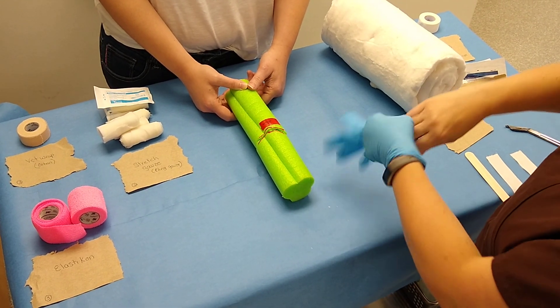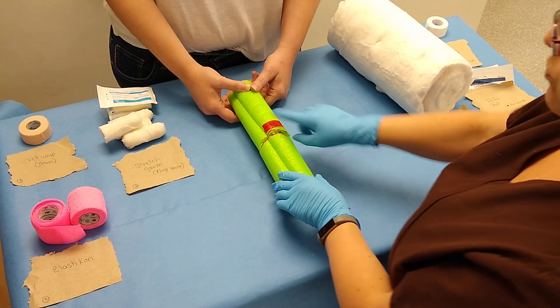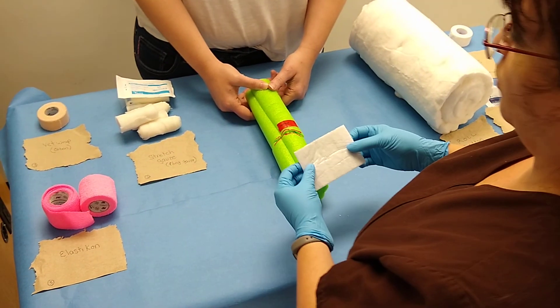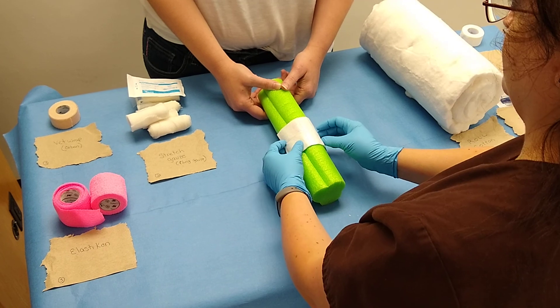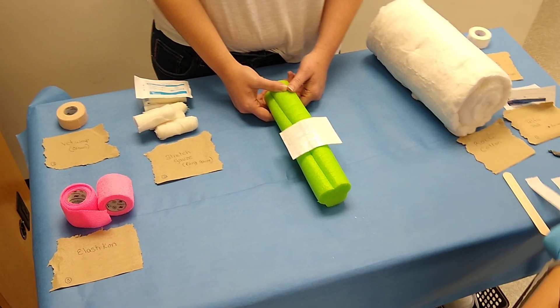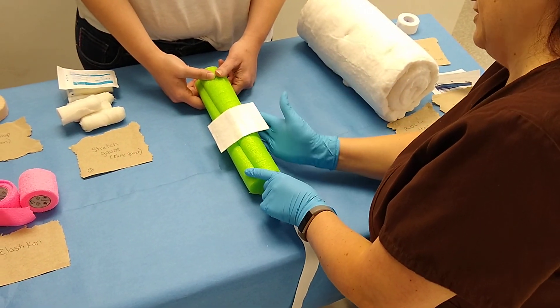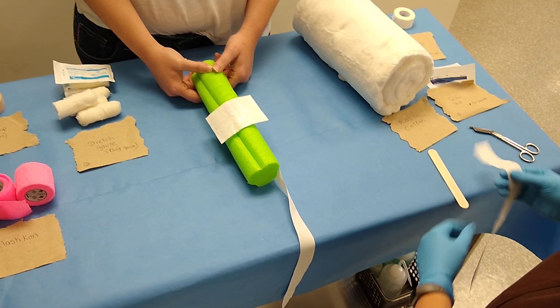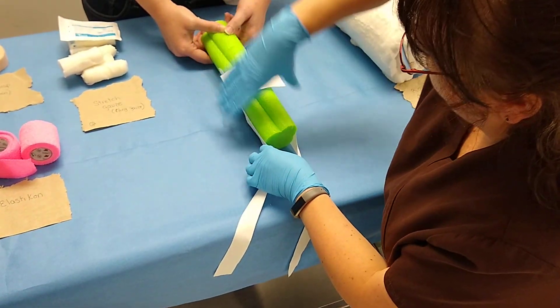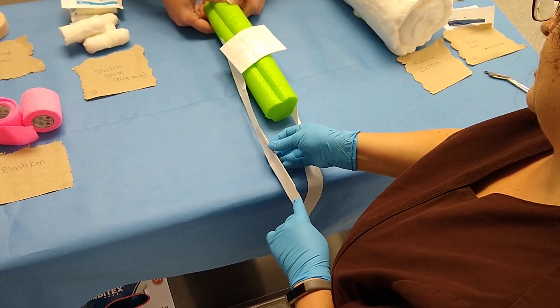We're going to place our gloves on. Because there's an open wound here, you don't want to get the bandage material into that wound and you don't want it to stick to that wound. You're going to place your telfa pad right over top of it and then you're going to place your stirrups on your patient. Again, you don't want to place your stirrups over your wounds. Use your tongue depressor to keep your tape from sticking to itself.